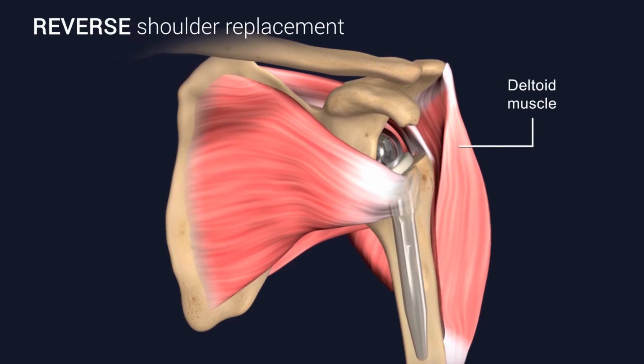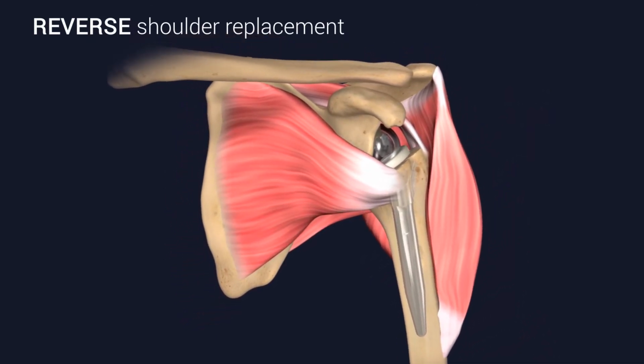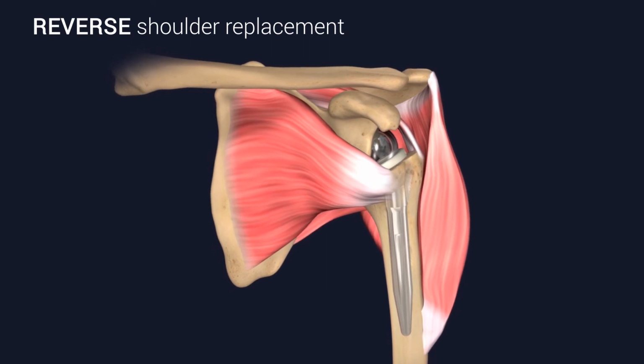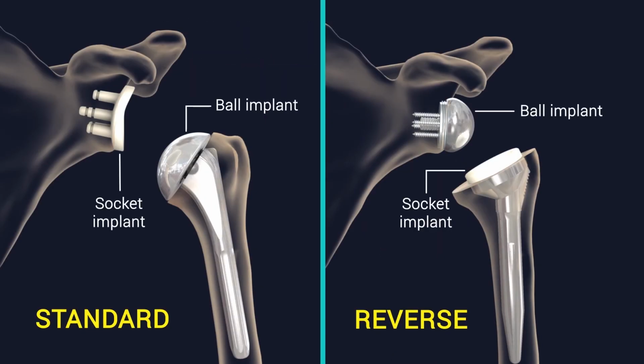A reverse shoulder replacement allows the deltoid muscle in the arm to take over movement of the shoulder joint from the weak and injured rotator cuff. In this repair, the position of the ball and socket are reversed. The socket implant is attached to the top of the humerus, where the ball or head used to be. And the ball implant is attached to the scapula, where the socket used to be.